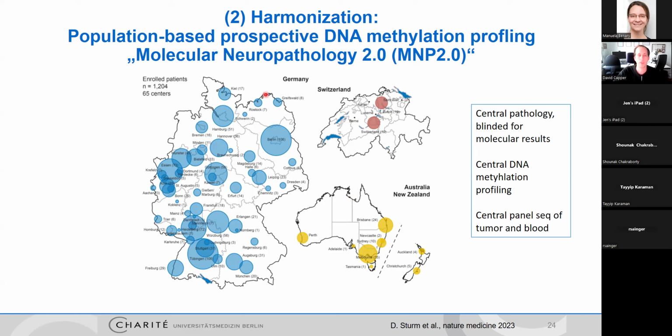And there have been other sets, in particular we've been working on sinonasal cancer, for example, that have also produced something like an organ classifier, meaning that if you have a tumor in a specific region and you're not sure what it is, you can do a methylation profile and then compare with such a classifier and will get a prediction, or the information, no, I don't know this tumor class.